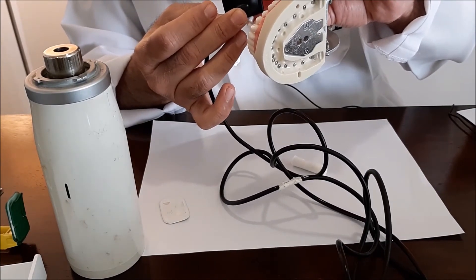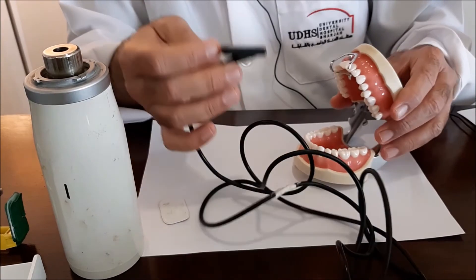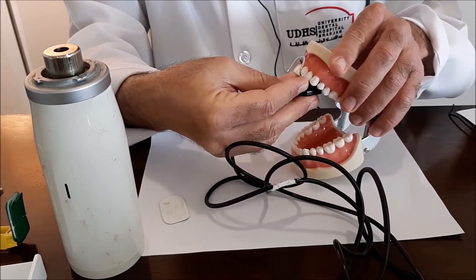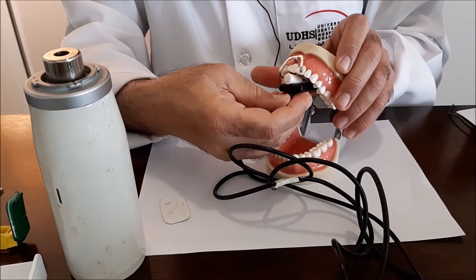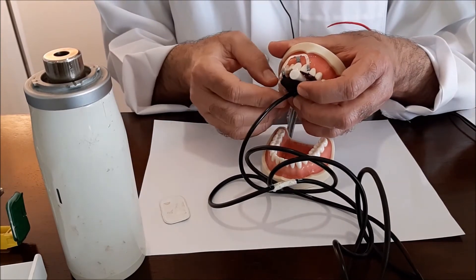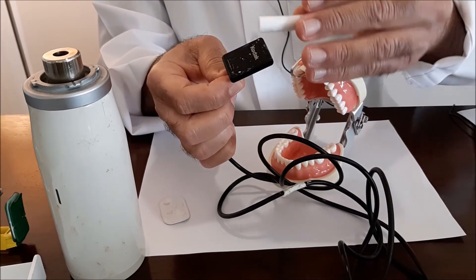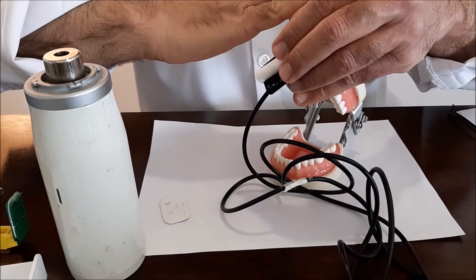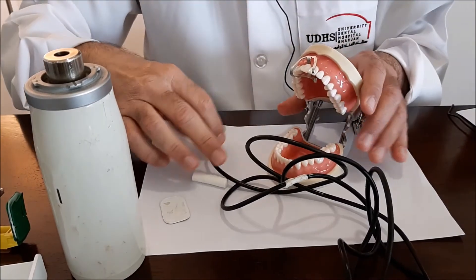So this is the case without a cotton roll — we are trying to extend it as much as we can posteriorly, hoping that we will get the apex. But if you put a cotton roll in between and then push it backwards, you will get a better relationship. You instruct your patient to support the sensor. The slanting has been reduced because instead of a steep inclination without the cotton roll, it will now assume a flatter direction. This will help us in directing the beam correctly.